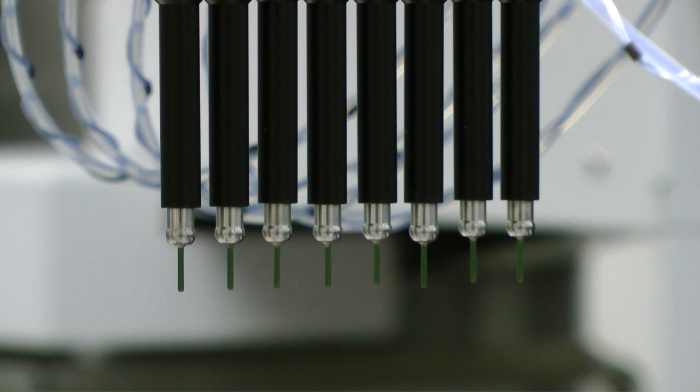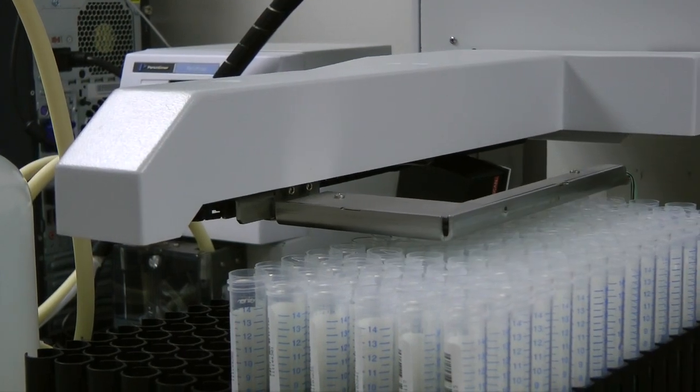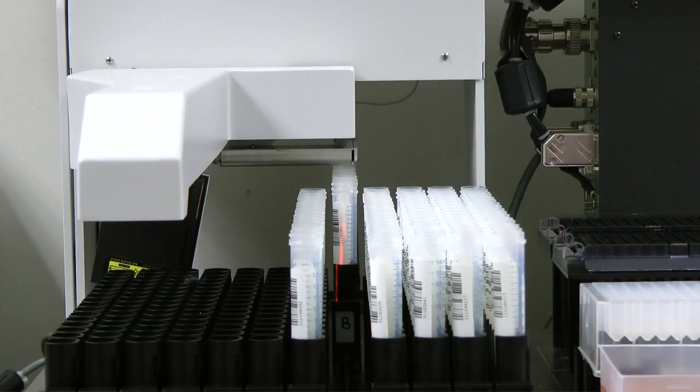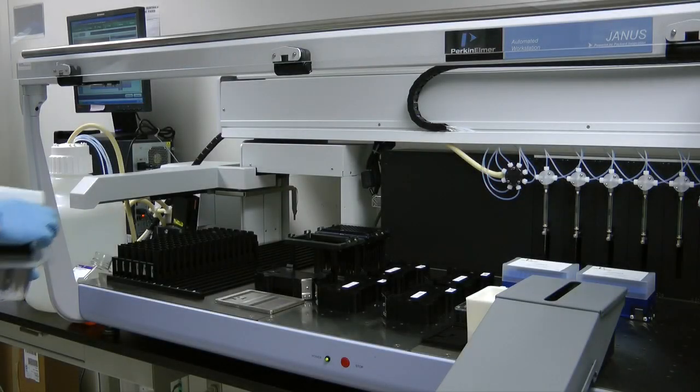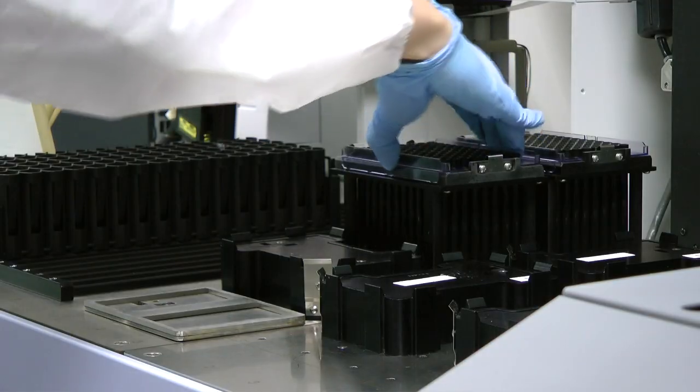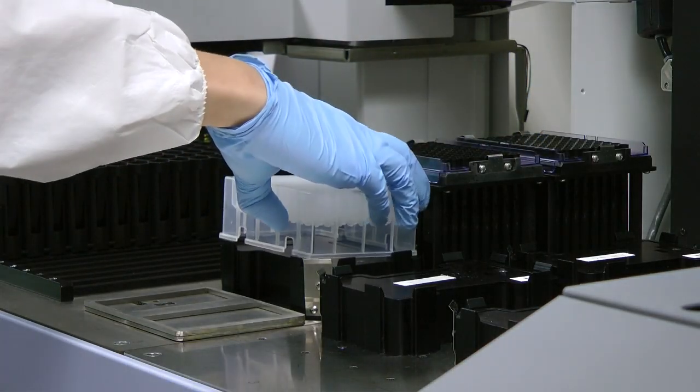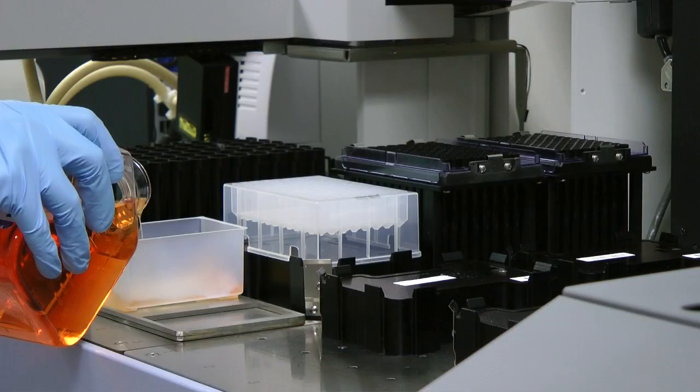The instrument has an eight-tip pipetting arm to increase speed, utilizes barcode technology to identify samples, and has detailed software to track all movements. The technologist loads necessary labware for the cell dilution step: filtered pipet tips, a sterile deep well plate, and a sterile trough containing AIM-5 cell culture media.